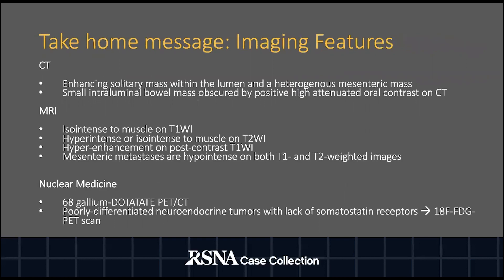On CT imaging, small bowel carcinoid tumor presents as an enhancing solitary mass within the small bowel lumen with a heterogeneous mesenteric mass. This intraluminal bowel mass can be obscured by high-attenuation oral contrast. On MRI, carcinoid tumors are iso-intense to muscle on T1-weighted imaging, hyper-intense or iso-intense to muscle on T2-weighted imaging, and hyper-enhancing on post-contrast T1-weighted imaging. Mesenteric metastases are typically hypo-intense on both T1 and T2-weighted imaging. For nuclear medicine, 68-gallium DOTATATE PET-CT and 18F FDG PET scans can be helpful for diagnosis.